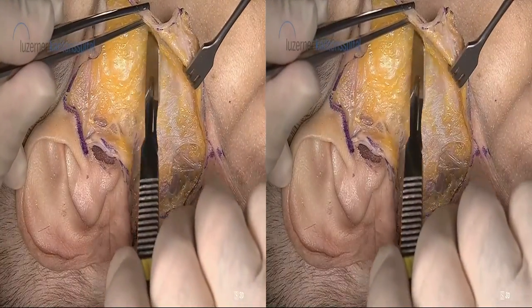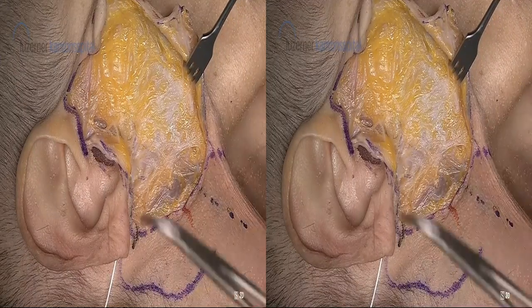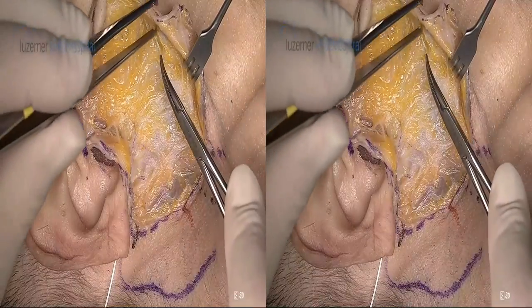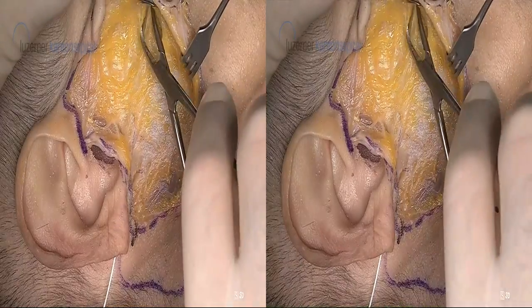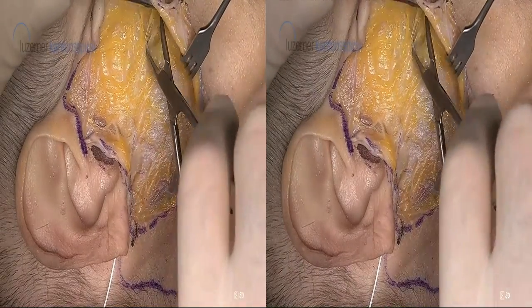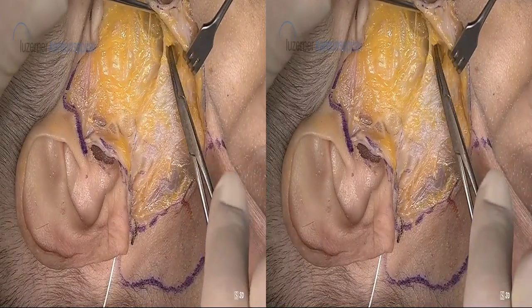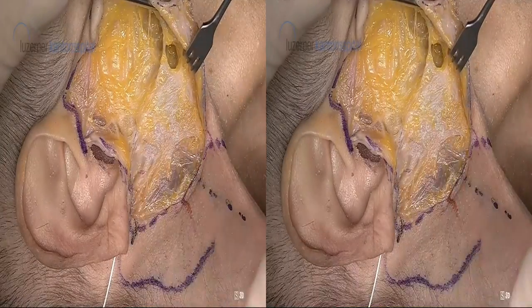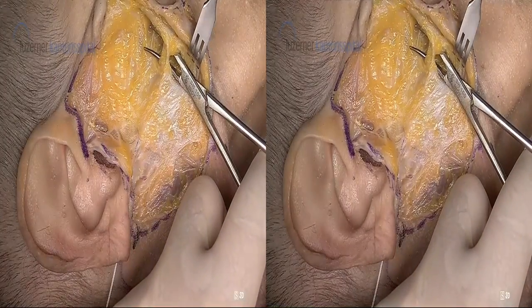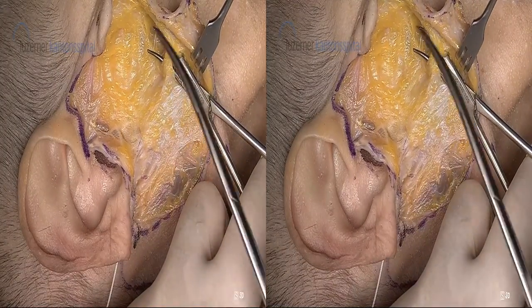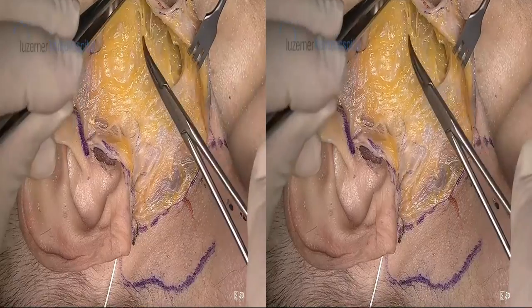At the outer border I usually prefer the tunnel technique, also in parotid surgery. So if you go here and you make a tunnel, because you're coming to the anterior edge of the parotid gland, the facial nerve will not go into the skin. So by tunneling between subcutaneous tissue and skin, you know that you're not cutting into facial nerve branches here. Because again, the facial nerve goes into the musculature. So having it here, we can easily and safely dissect anteriorly to the parotid, where the facial nerve becomes more superficial.